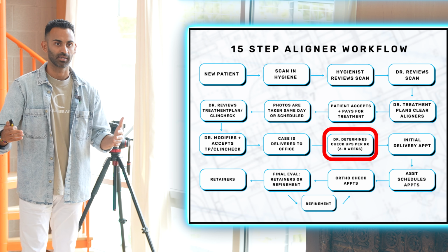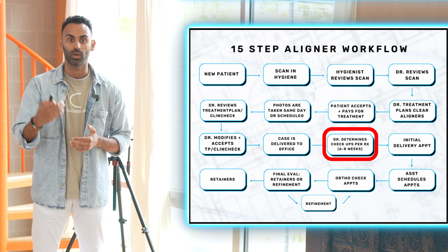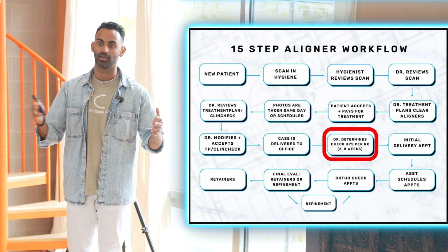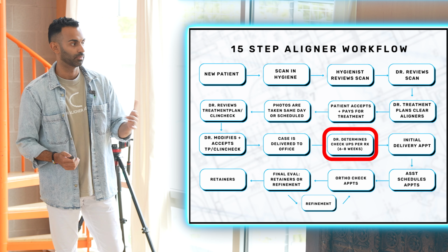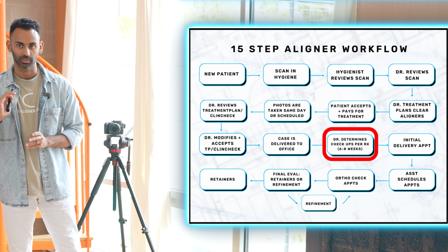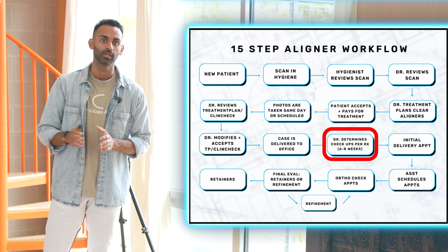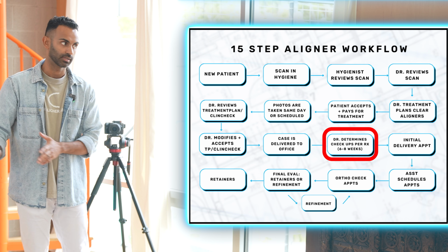That gives you enough time to make any modifications you need, as well as giving you delivery time for the case. Different brands have different lead times. Some are as little as 2 weeks, others as much as 4 to 5 weeks. So we always book the patient about 4 to 5 weeks out, so that you have enough time for the modification and for delivery.